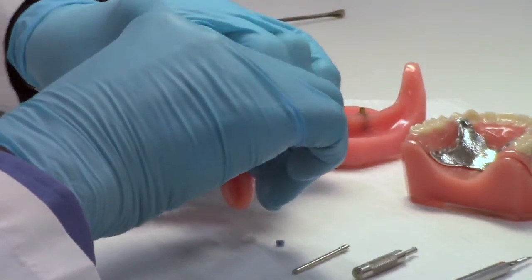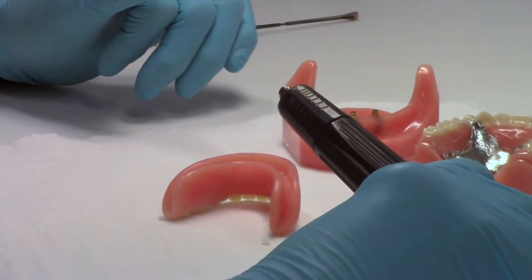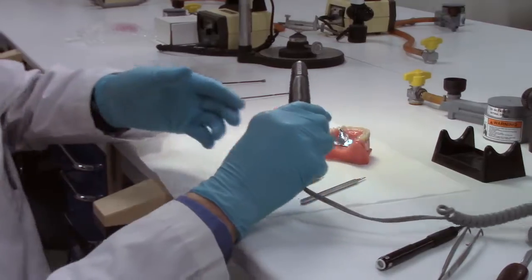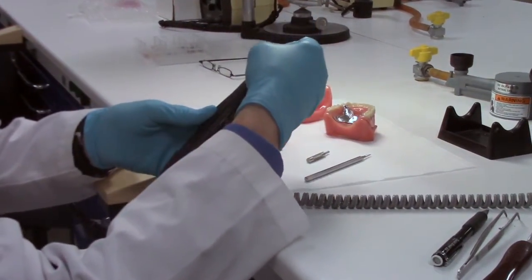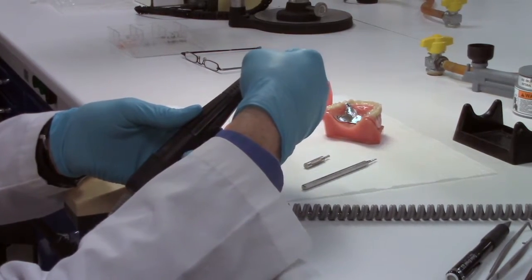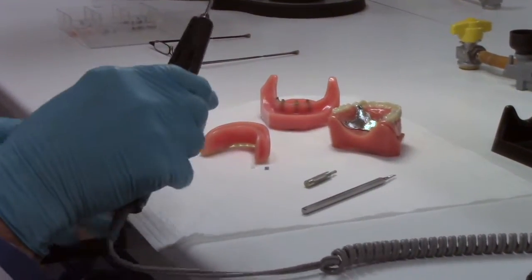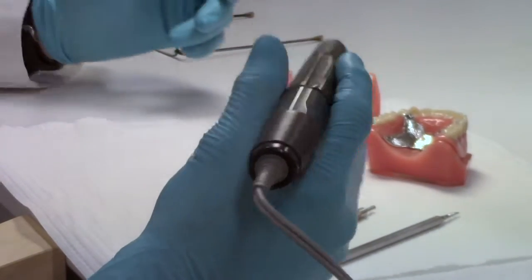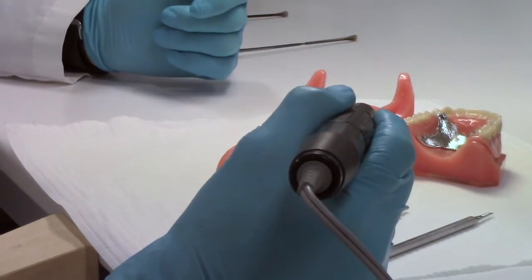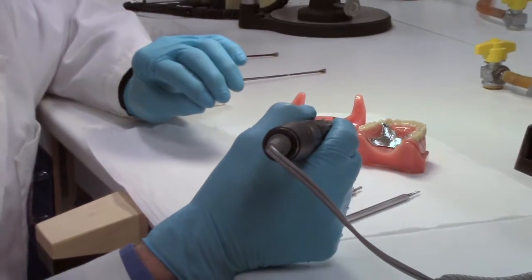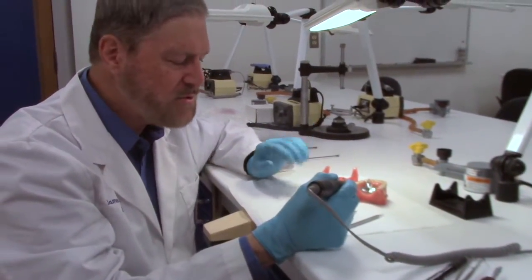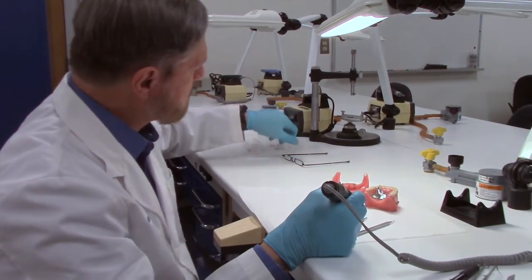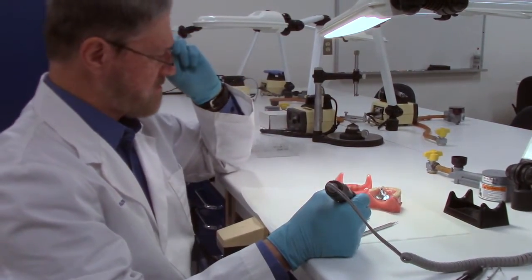So let's take the overdenture. You'll need a straight laboratory style hand piece. And we're going to put the core cutter bur in and tighten that. Now I like to hold it kind of like a pencil. I'm going to put my glasses on so I can see what I'm doing.